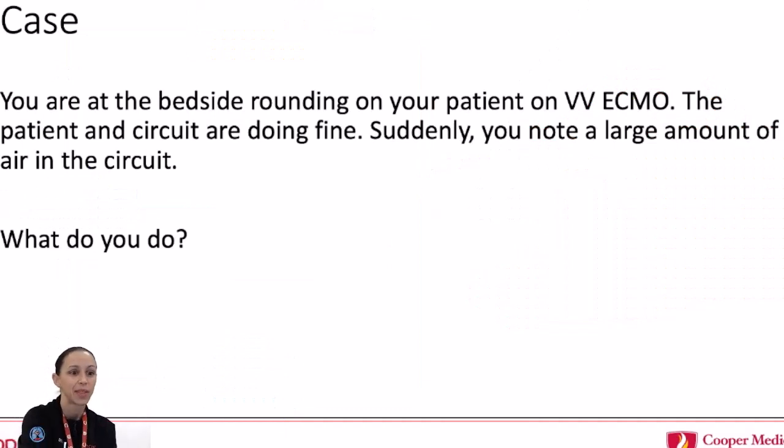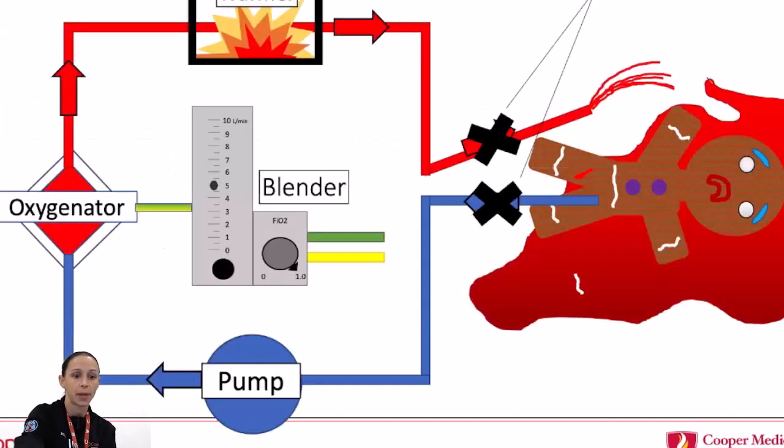I would just say, the friction connections that you get when you put somebody on initially are tight. But in this particular situation, he was on ECMO for 60 days or something like that before it popped off. Over time, with the heat and everything else, the tubing becomes more pliable, and they're easy to slip off. So you'll see that they put these little zip ties to help maintain that friction connection. That's a really good point.